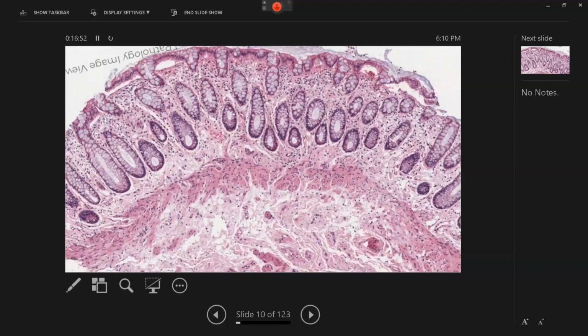For example here, if you look at the side of these slides, let me just mark with a pen. Actually, you can start counting the inflammatory cells, and you probably will be able to give me a number if you spend a minute or so counting them. That shouldn't really be the case, because you should not have the luxury of being able to count how many inflammatory cells there are in one field.